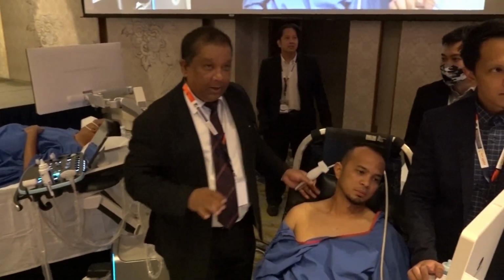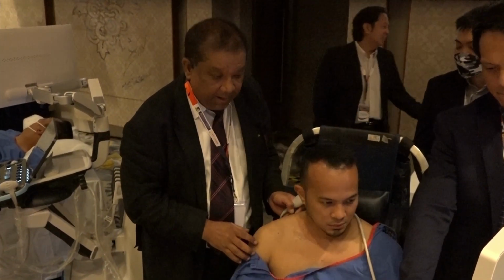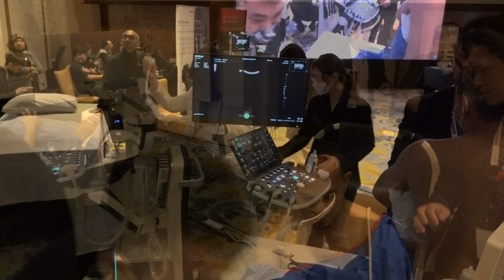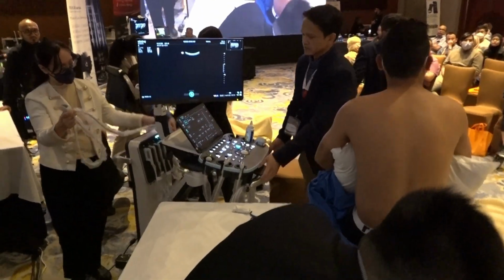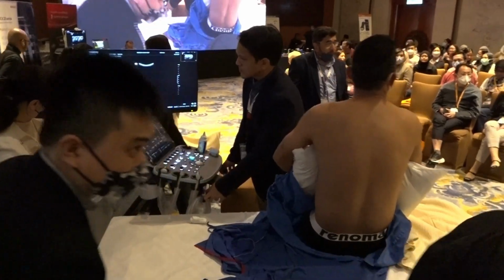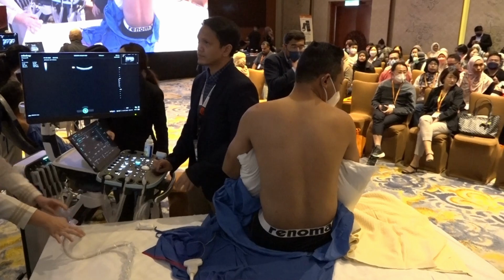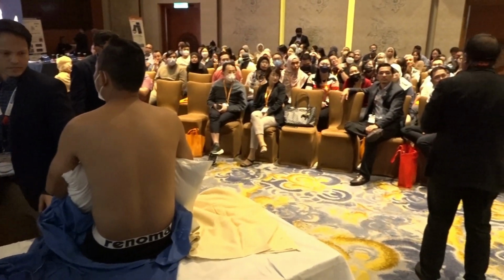Okay, now I'm going to do the paravertebral scan. We'll do this on this one. I remember the gentleman who was presenting the paravertebral injection did an excellent job. He really revealed to you his sentiments. Did you hear what he said?